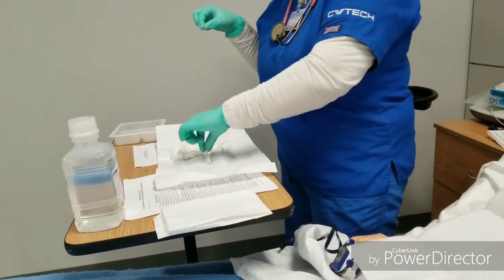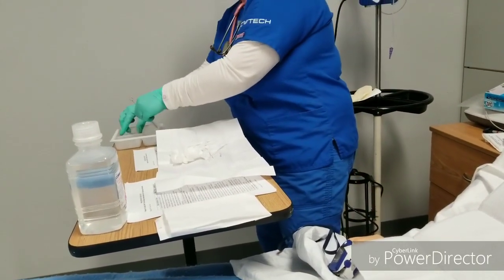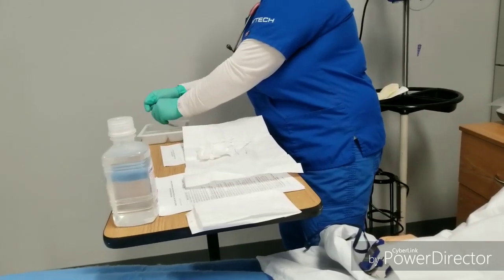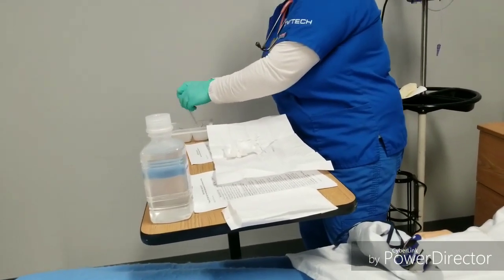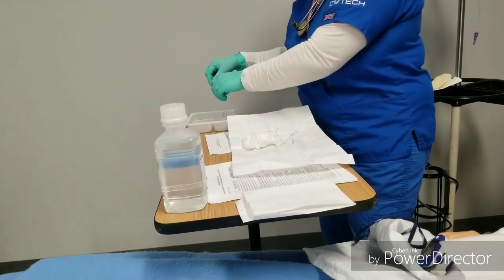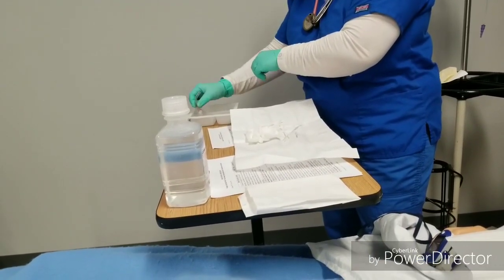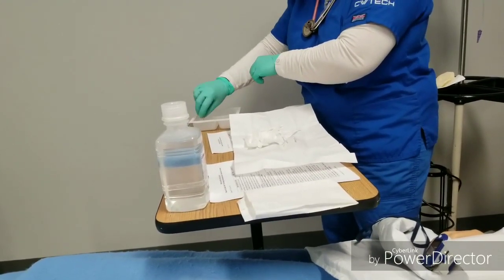And you can use this. You're going to let it soak in there, make sure you get down in there, scrub, scrub, scrub, get all the secretions. And then I'm going to throw this away. And there's a trash can down there. Now I'm going to drop this into the saline for rinse, and you want to make sure that you rinse it a few times.